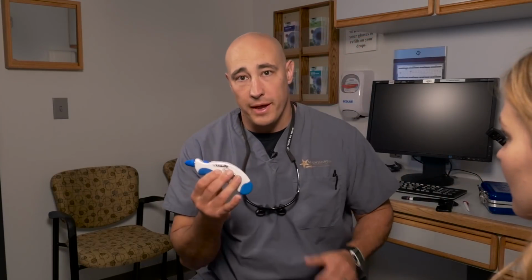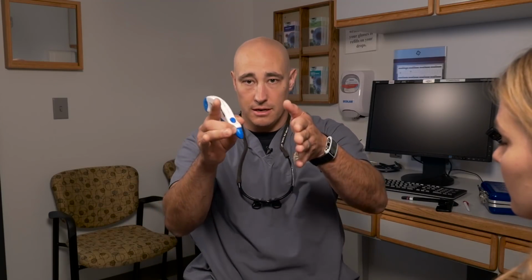I like to use a Tono-Pen, especially because as part of an orbital exam, I like to check the intraocular pressure in different positions of gaze. That's very important with things like thyroid eye disease and fractures, because if an orbit's very congested or there's an entrapped muscle, the pressure will oftentimes rise in the eye when they go off of central gaze. So, for example, with thyroid eye disease, I always check with the patient in primary gaze and then with up gaze. And if there's a significant difference between those two, that makes me more worried about a congested orbit.